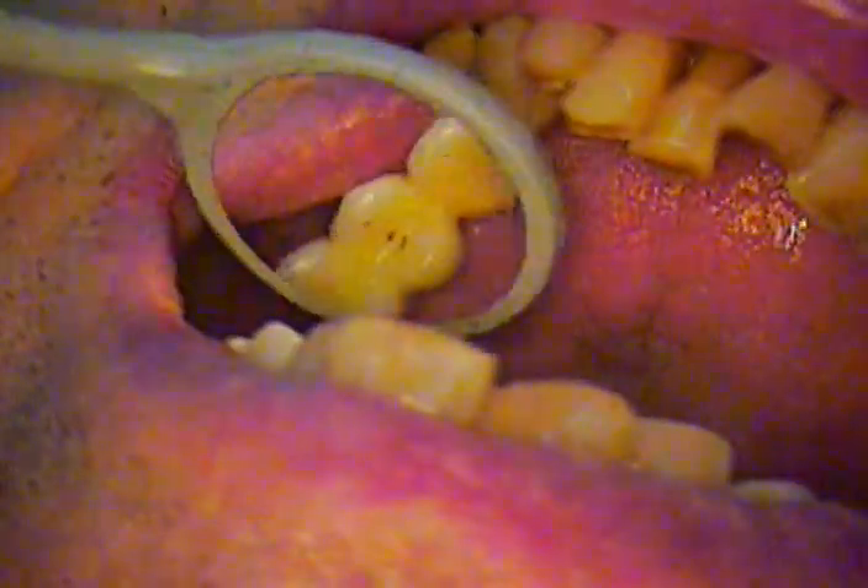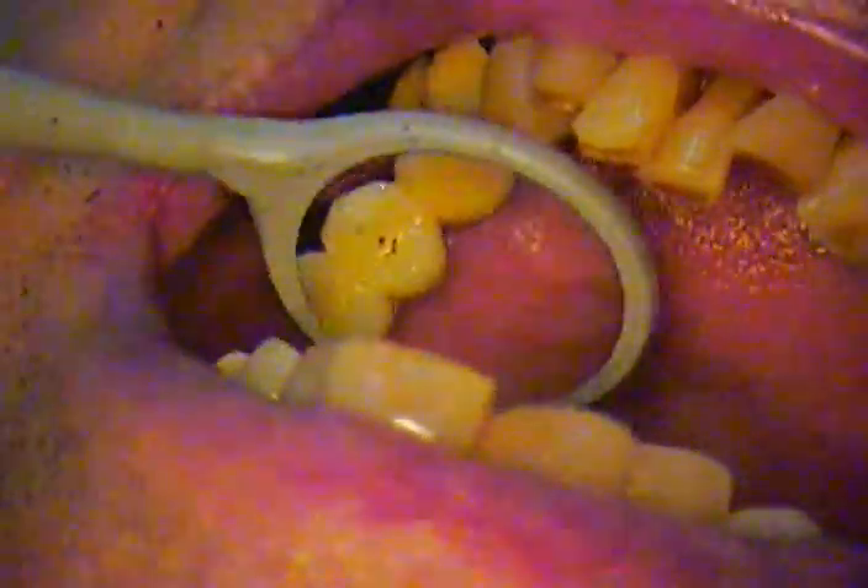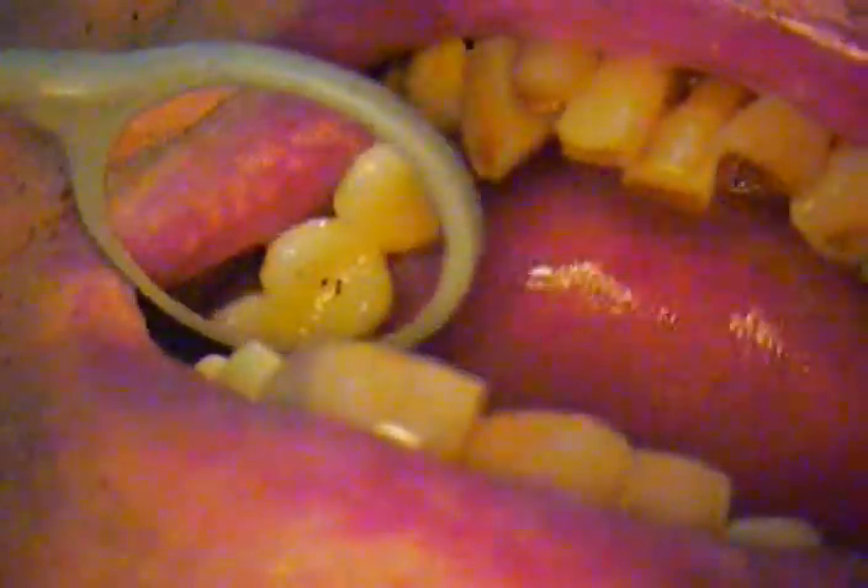Hello everyone. We're back and we're ready to take care of that lower tooth number 22. As I stated before, this particular case is a bone level case. We have the upper bridge in, not cemented, no x-ray taken yet.